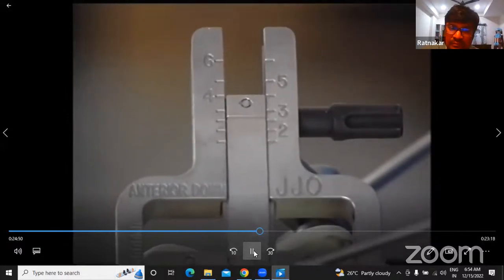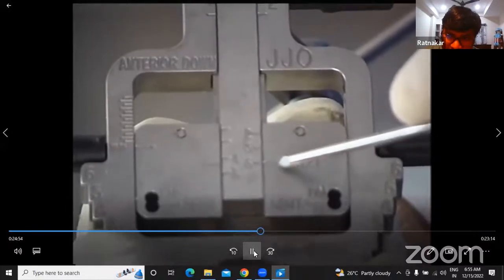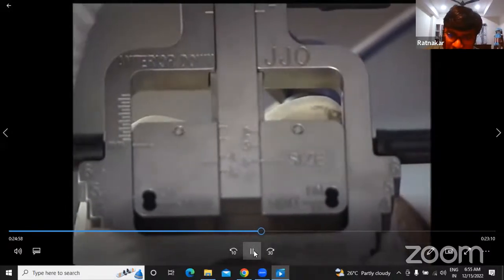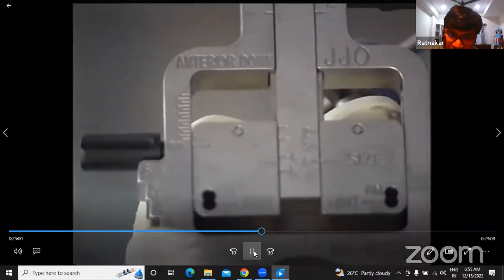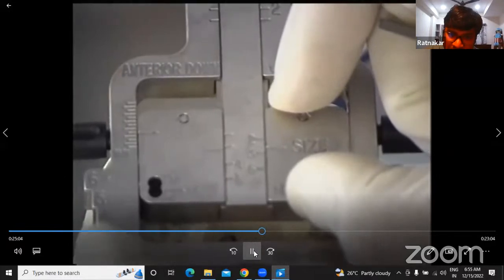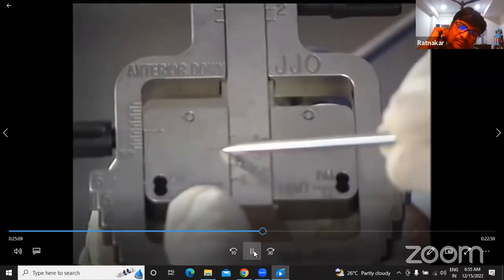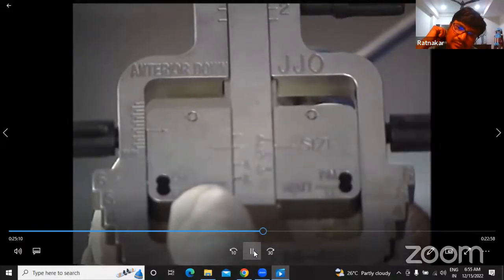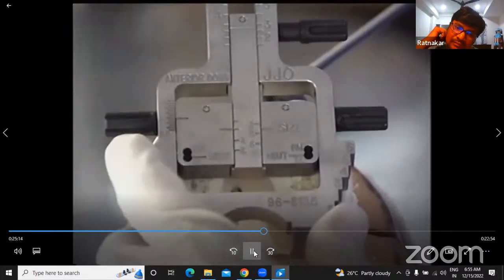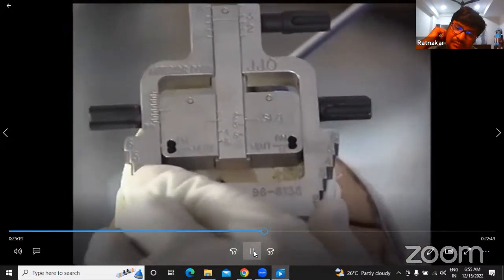Then if you move down, if you see here, actual size is here. Again, here the indicators are there. So you have to move this knob on both sides to 2.5. Yeah, you can see that is 2.5. It is connecting on both. Now tighten these two knobs. Okay, and now you are ready to fix this to the femur with the pins.